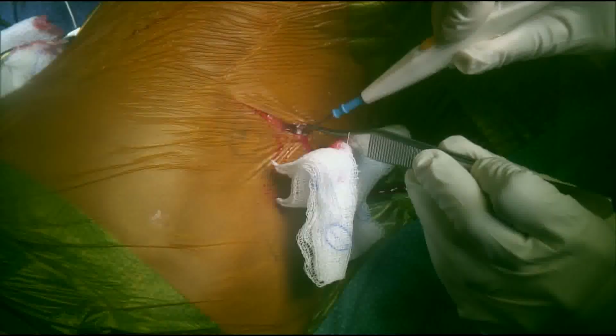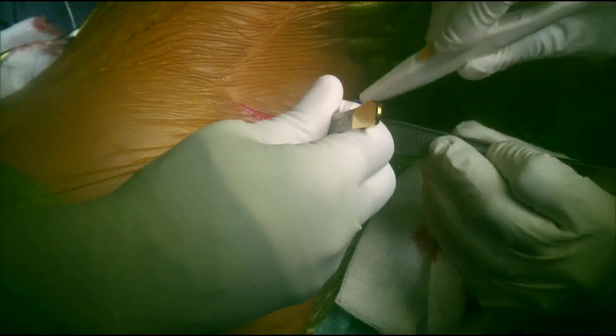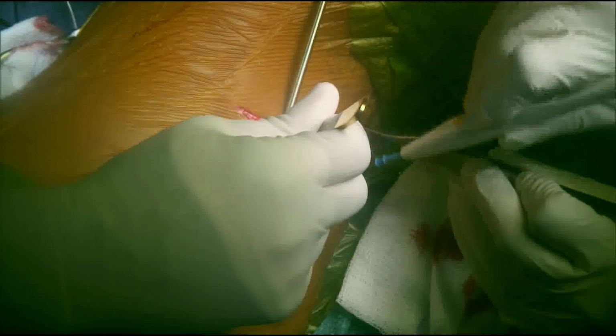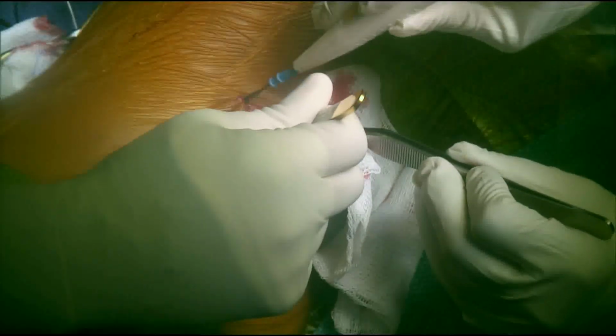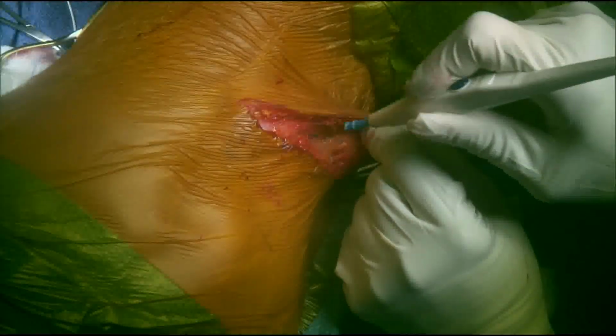The abdominal pocket usually spans 4 finger breadths between the last rib and the top of the iliac crest. The horizontal skin incision should therefore start at the top or superior part of the 4 finger breadths, and this is usually marked before the start of the procedure. In case the patient has scoliosis, especially in the lumbar region, the pump should be placed at the convex side of the curve.